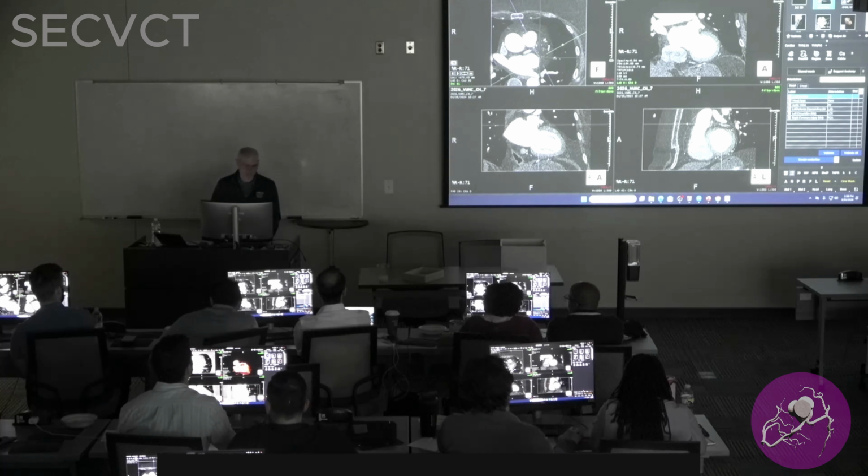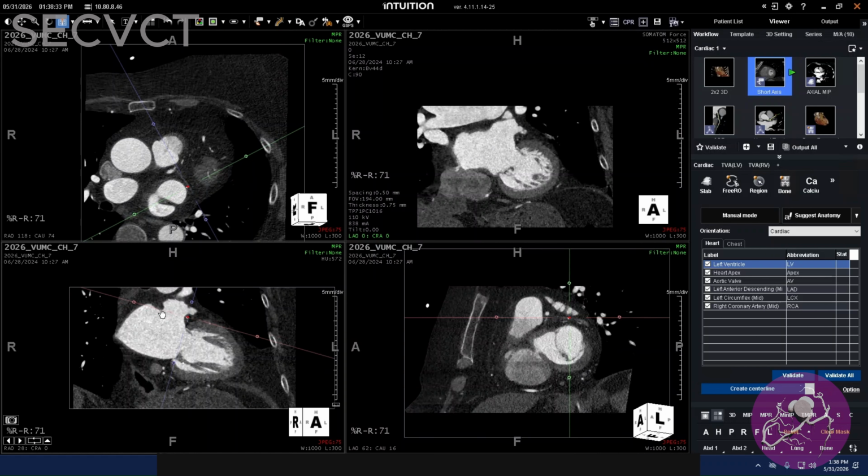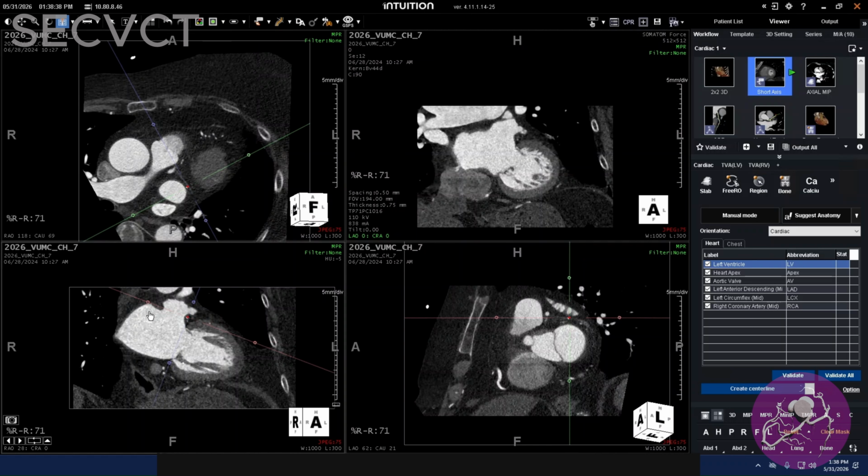So right here. So now you go into the two-chamber view here. And you're going to take this, and this is Coumadin's ridge right here. And you're going to angle up, so you've got a plane through this ostia of the left atrial appendage.